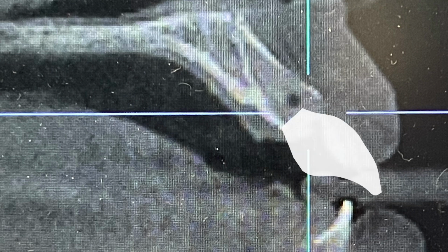This is the pre-op CT. This is the proposed restoration shape, and this is the proposed implant position based on that, which means the implant is going to go into the palatal aspect of the socket, leaving somewhat of 2, maybe slightly more than 2 millimeters of facial gap, which will be filled with biomaterials to allow regeneration of bone or hard tissue in that plane.